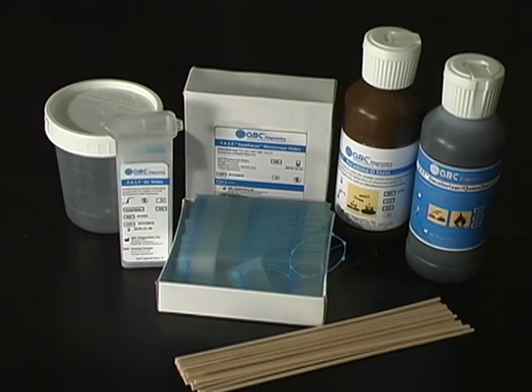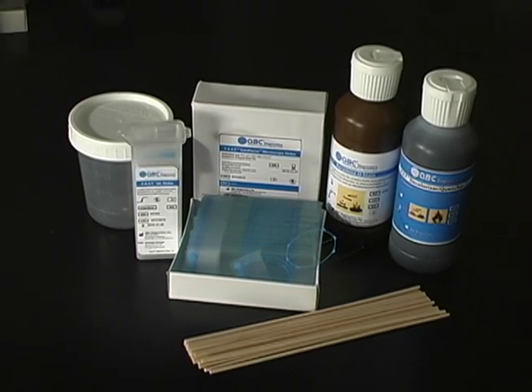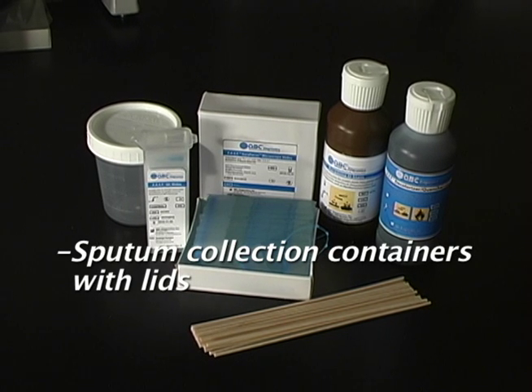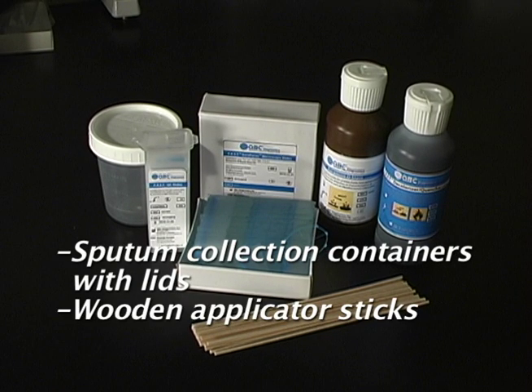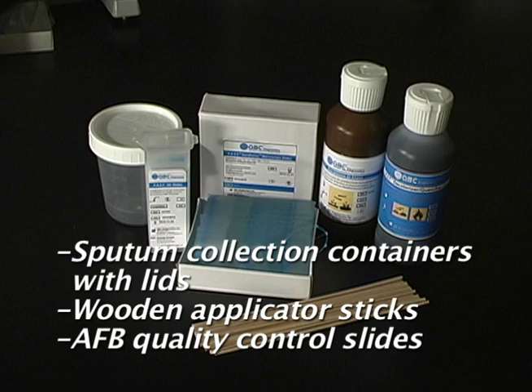In addition to these components, your Fast AFB Smear Kit contains the following: sputum collection containers with lids, wooden applicator sticks, and AFB quality control slides.